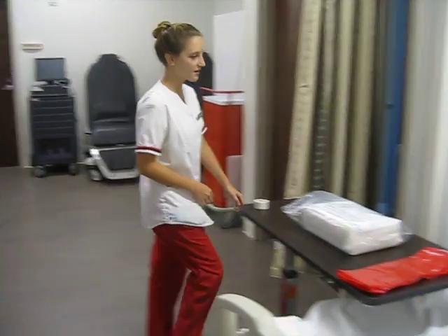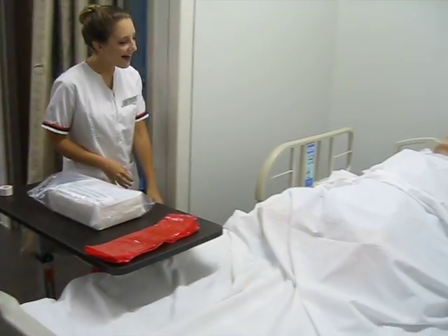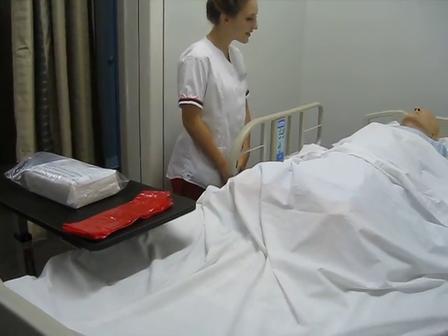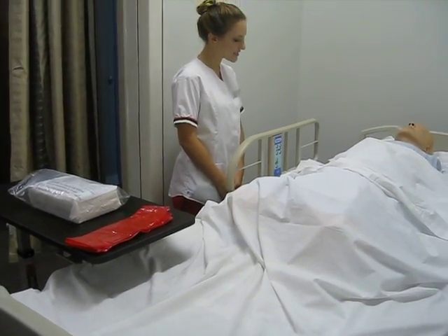Before entering the patient's room, I have already assessed and cleaned the patient's peri area. Hello, my name is Janie, and I will be your student nurse today.